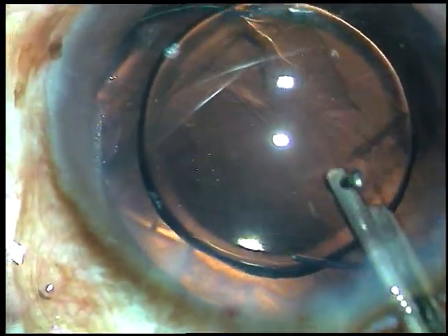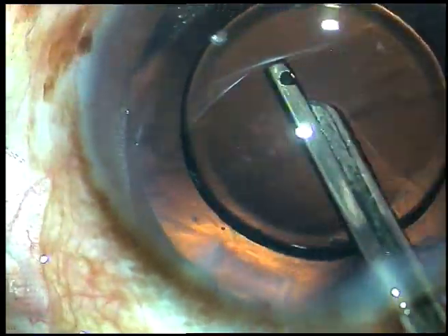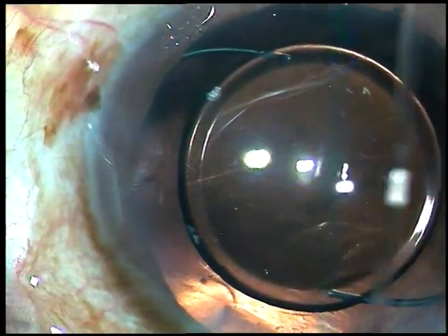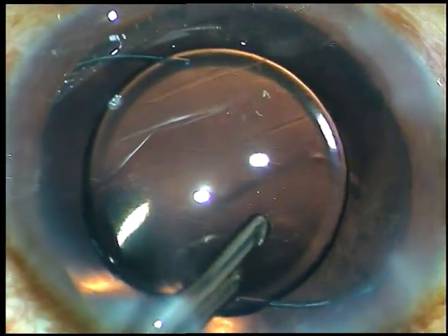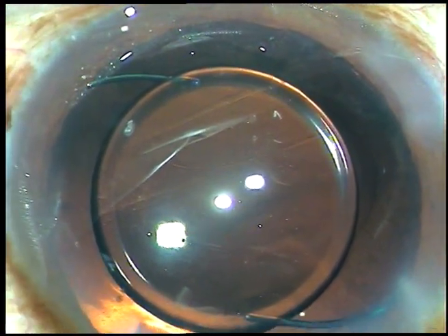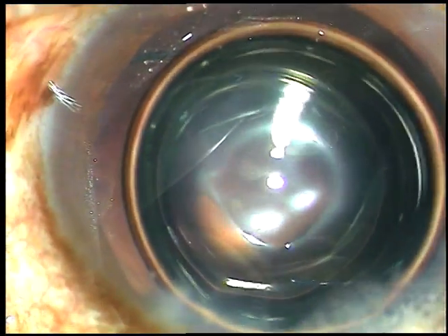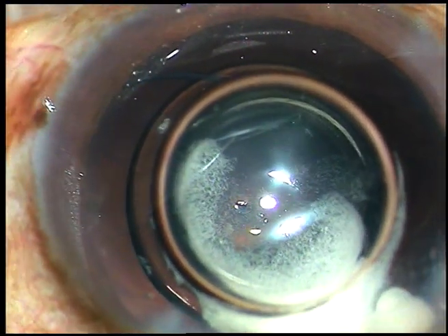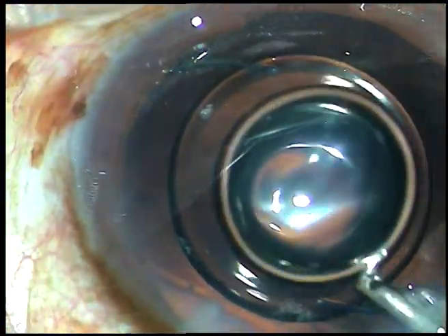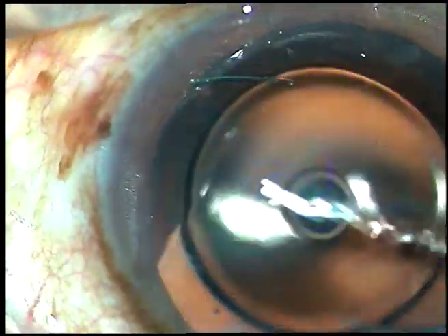Now viscoelastic substance is removed using a Simcoe cannula. Just for confirmation, I am going to use triamcinolone acetonide to check if there are any vitreous strands in the anterior chamber. I inject a bit of triamcinolone, wash it out, and find that there are no vitreous strands in the anterior chamber.